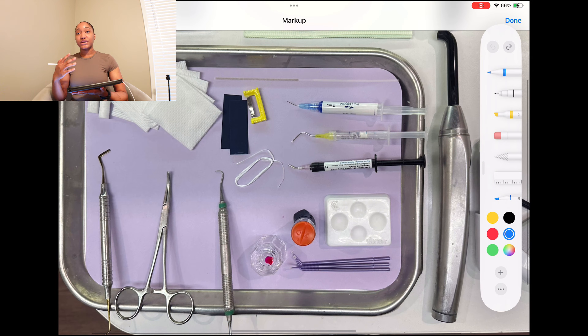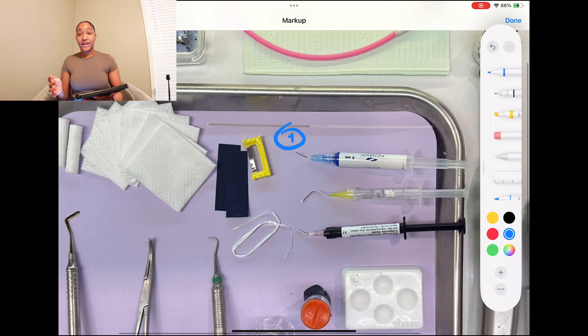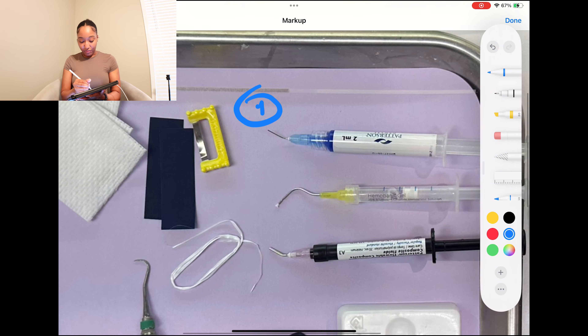Now let's actually get into the steps of filling up the tooth. If you just want the straight order — high speed, slow speed, etch, bond, and so on — here we go. Etch is usually step one in the beginning of the procedure. You place that on and etch is supposed to sit on the tooth for about 10 to 20 seconds, usually 20 seconds. My dentist leaves it on for about five seconds — that's just her method. After that, you are going to rinse.